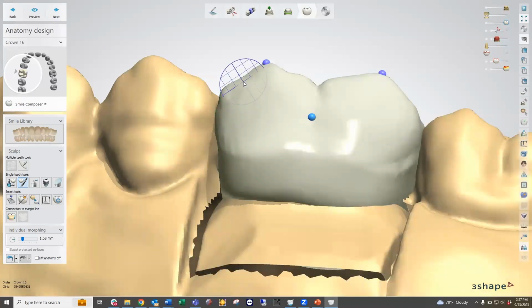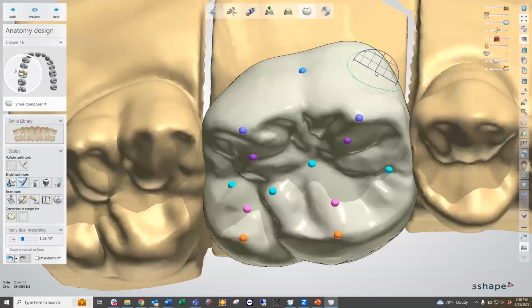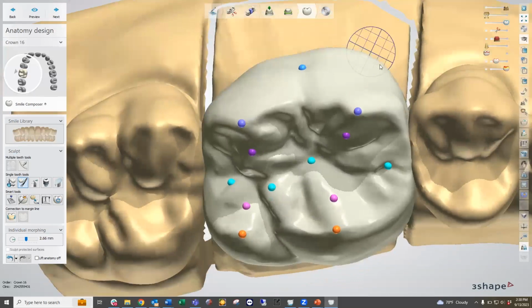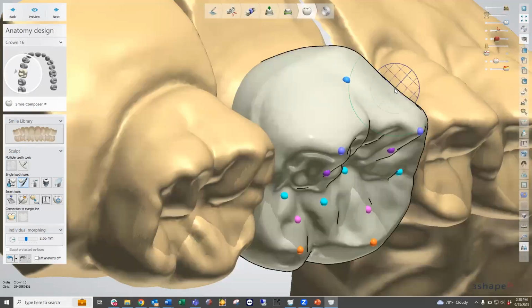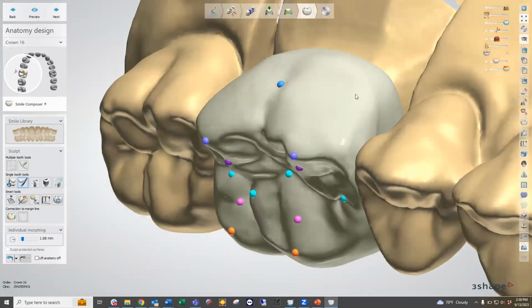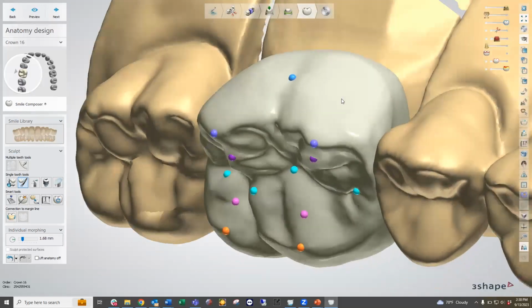I can say maybe I didn't like that change that I did over there. I'm going to go ahead and bulk this out. And just try to get this into place where it looks like you're happy with what you've done. Okay, maybe I've done too much in this area. And go ahead and make those intermediate changes that we talked about earlier. Okay, so again, making this change out like this. Just looking to get it relatively into a good position that we like.